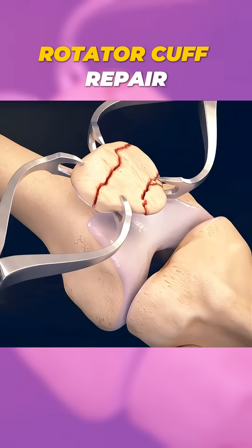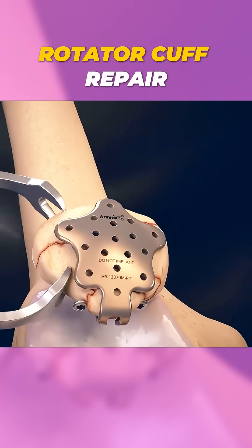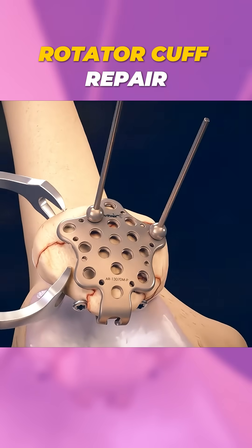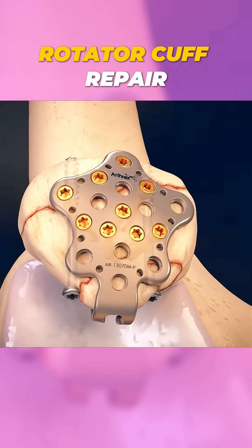Ever wondered how doctors fix a fractured patella, the bone we commonly call the kneecap? When this critical bone breaks due to trauma, like a fall or a direct hit, surgery becomes essential to restore its function.